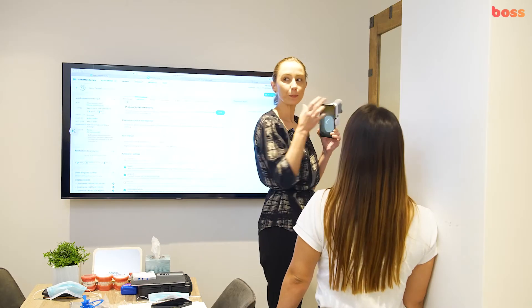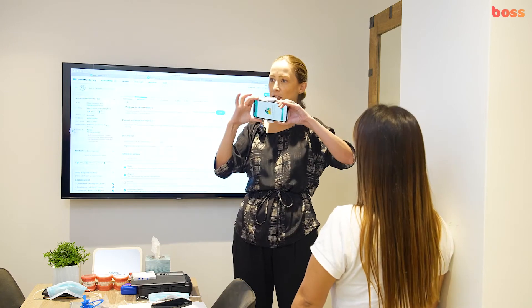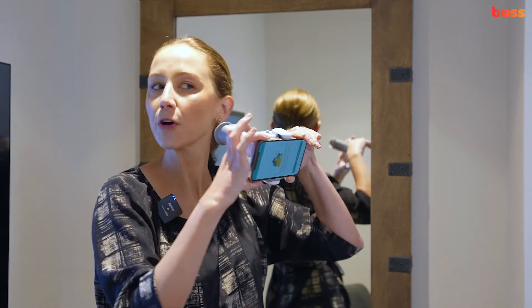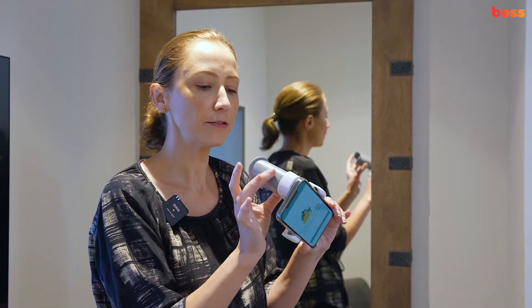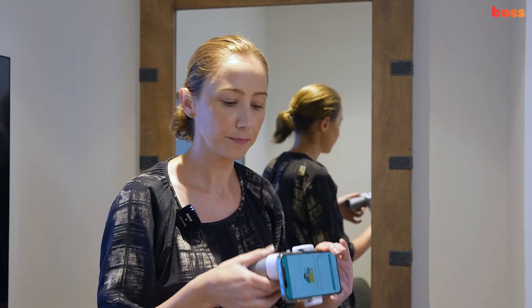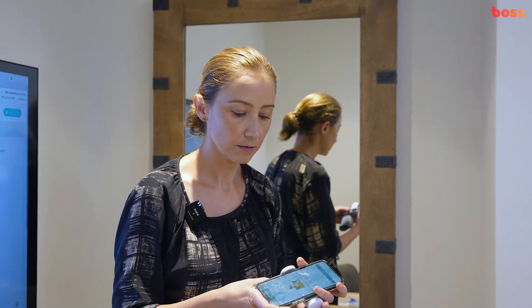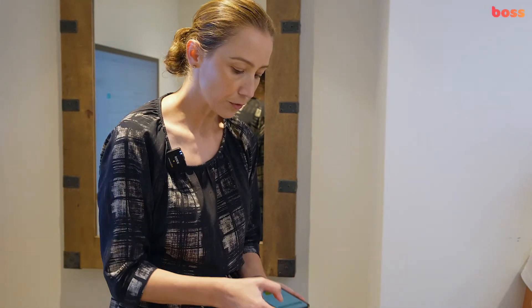You can now remove your cheek retractor. This is so much easier — the fact that you don't have to hold the whole box, you're just holding the phone. All you're doing is working against it: moving the scan box to one side while moving your head the other way. Because it's sitting so securely in the mouth, you don't see anything else but what's in the mouth. Once done, just release it.